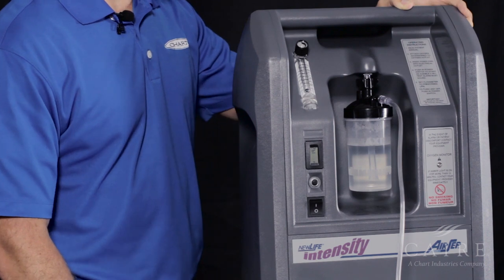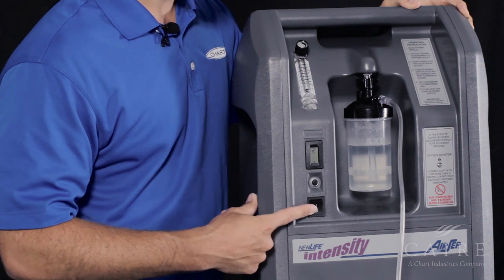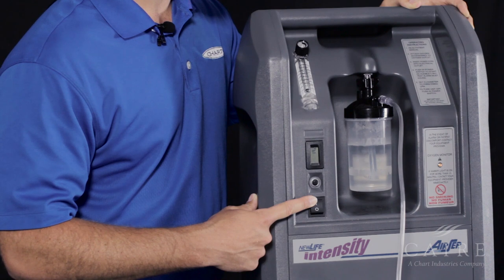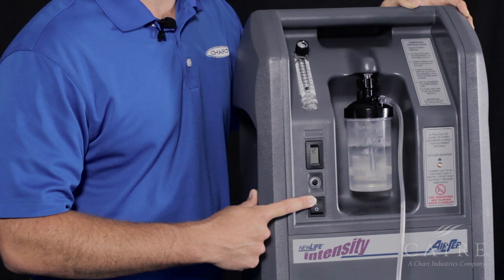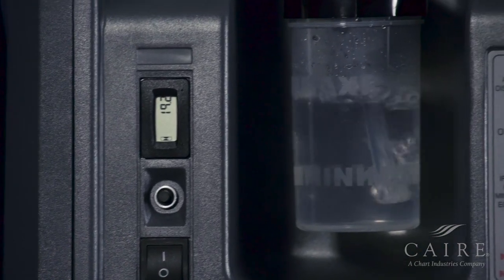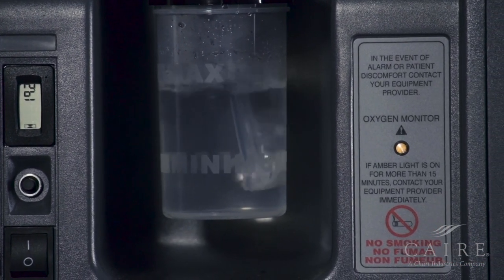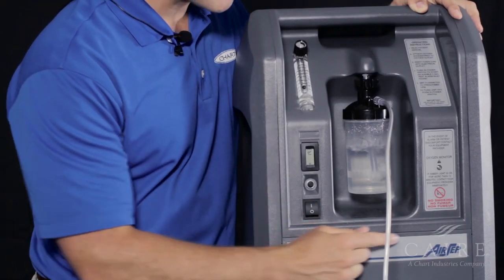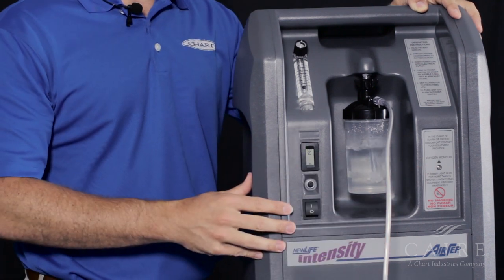Now that we have the unit hooked up properly, we can go ahead and turn on the unit. Simply turn the on button. You'll notice that the unit is going to alarm, which is perfectly normal initially. Another thing you're going to notice is that on the right side, your oxygen monitoring light will be illuminated — again, this is perfectly normal. This is known as the warm-up period. After the unit has warmed up, you'll notice that the yellow light is no longer illuminated; the unit is functioning properly and is good to use.